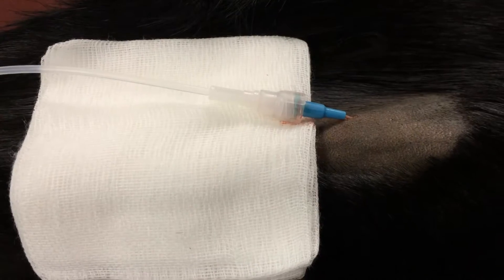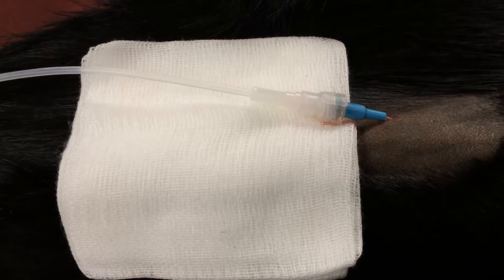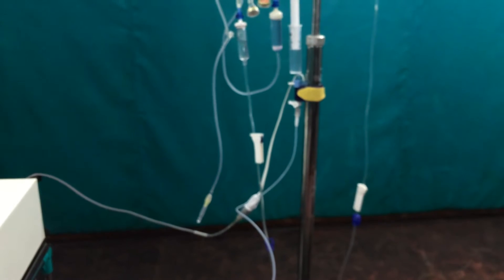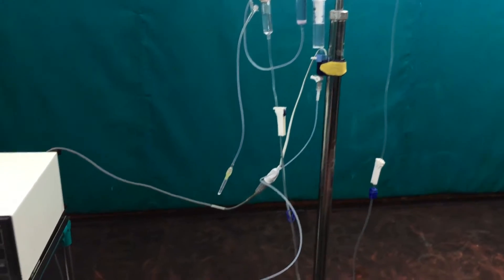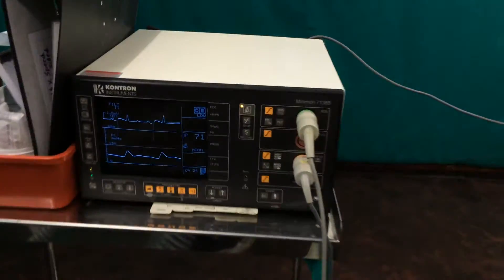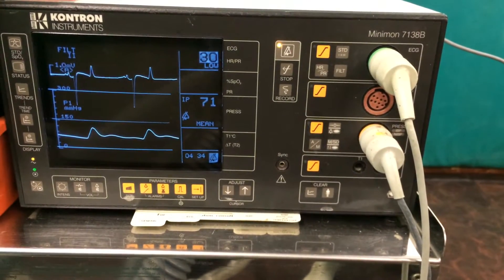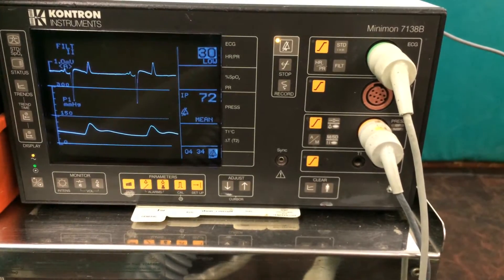Here we have direct blood pressure monitoring. This catheter has been placed into an artery and a tube then goes up to a transducer which you can see on the drip stand there, and from the transducer we then get a reading on our ECG and blood pressure monitor. It's the lower reading that's measuring the blood pressure and the mean blood pressure of this horse is currently 72, which is good.